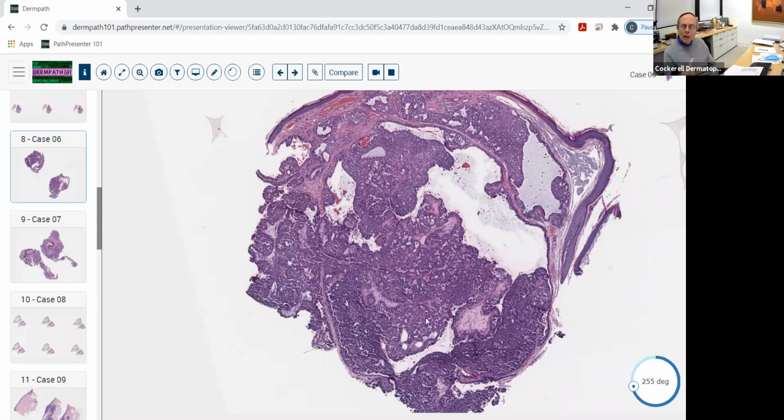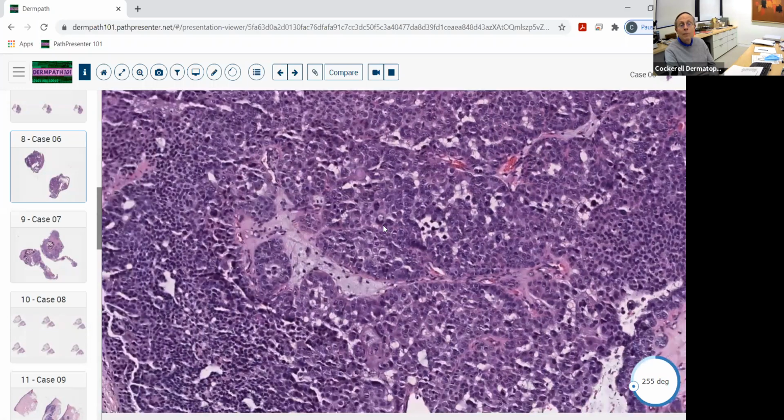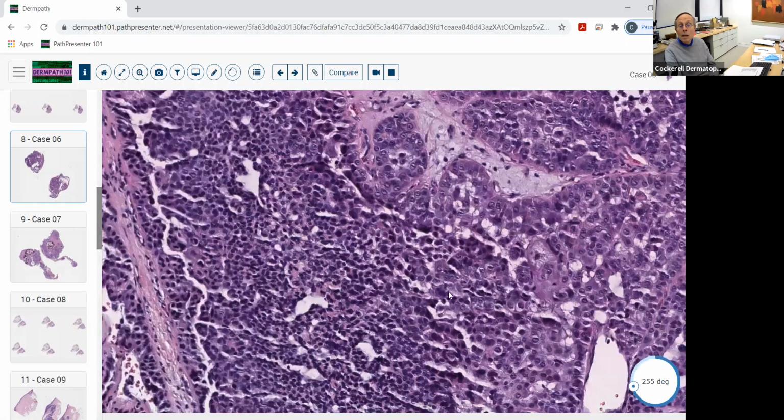But when you leave something alone in somebody for 50 years, 75 years, whatever, they can gradually develop little islands of cancer in them, and then they can become more serious. So you always need to make sure when you're looking at one of these, especially when they've been around a long time and have this solid component, that you look for areas where there may be some atypia and mitotic figures developing. And indeed, in this case, you can see that there is necrosis en masse here.